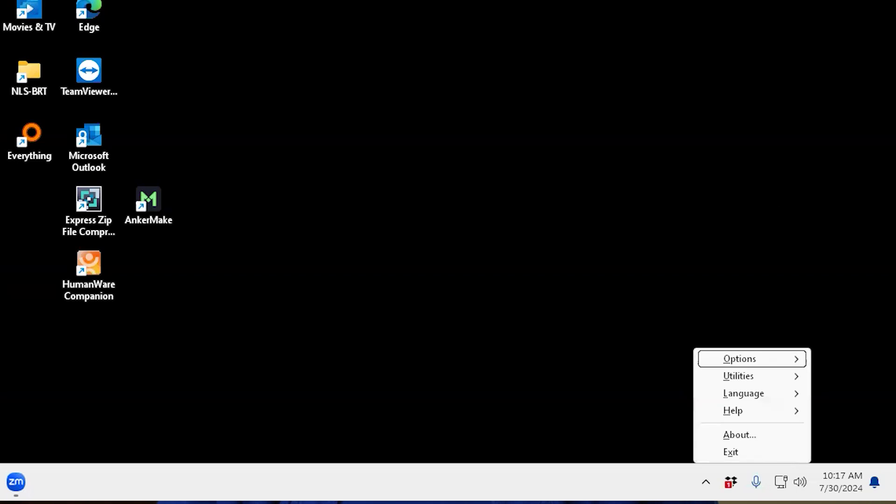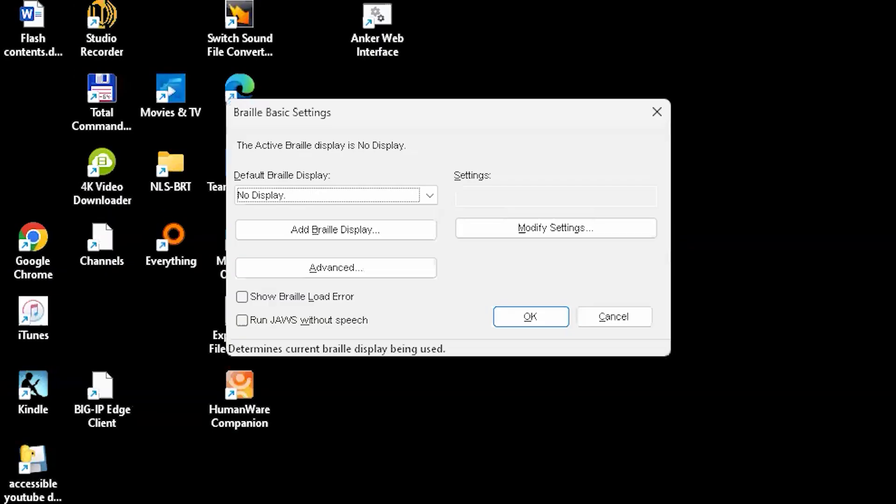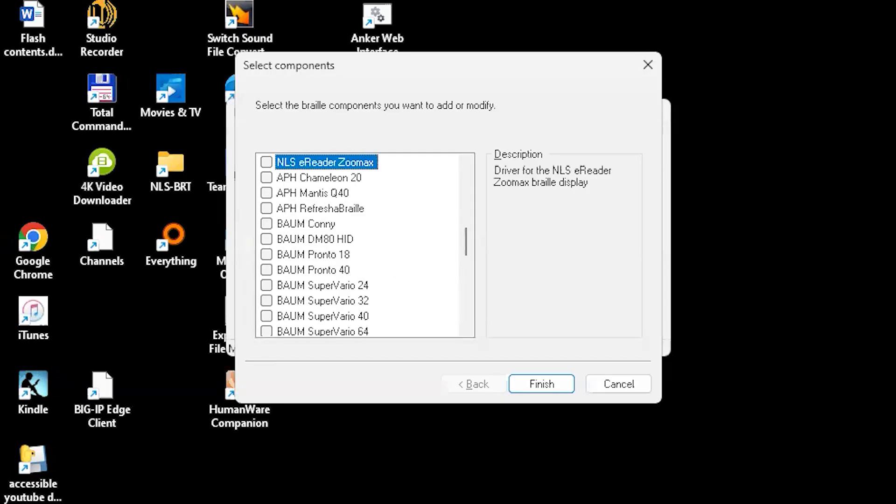Now, on the computer, open the JAWS control panel, select Options, then Braille. Tab to Add a Braille display and press Enter. A list of possible Braille displays will appear. Type the letter N until you reach NLS Braille eReader ZoomX. Press the space bar to check the box. Tab to Next and press the Enter key.